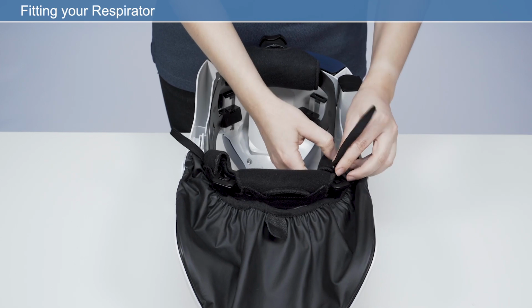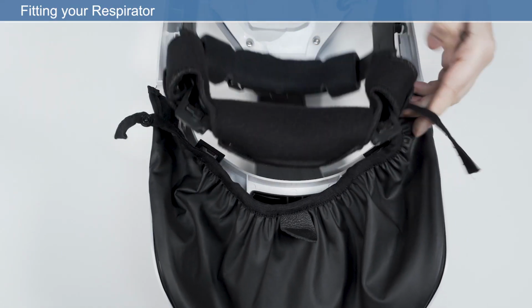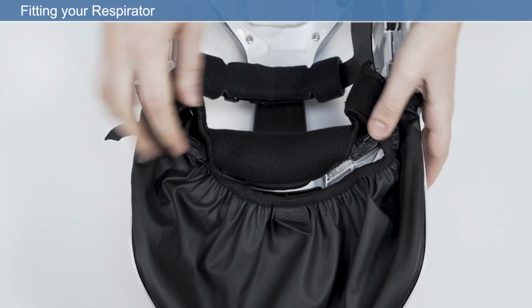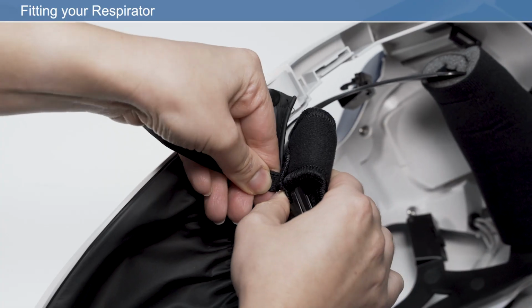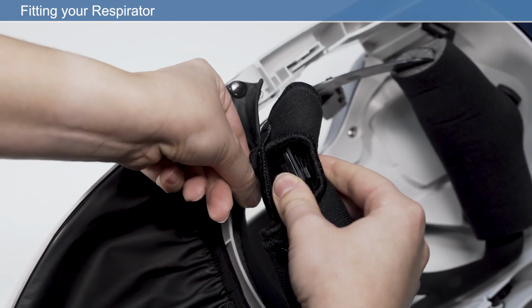Reattach the headband to the frame in reverse order, making sure it is locked into position. Reattach the face seal press fasteners to the matting press fasteners on the face seal. Ensure the elastic straps are routed around the headband.